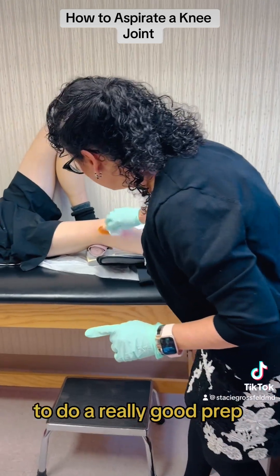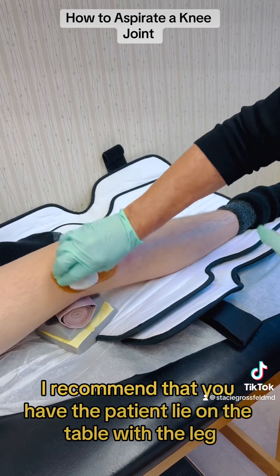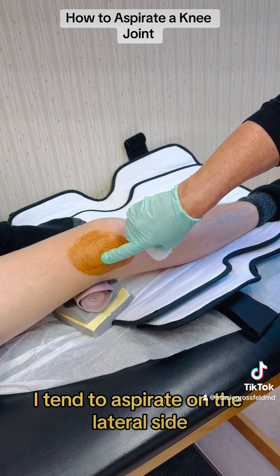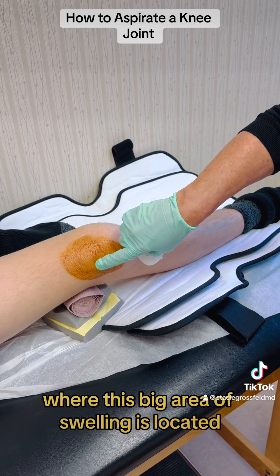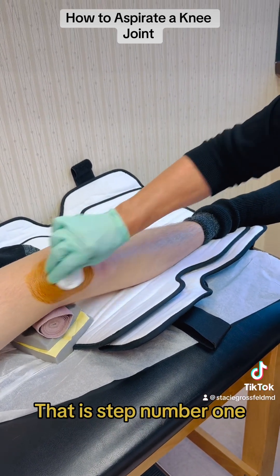Step number one: you want to do a really good prep. I recommend having the patient lie on the table with the leg in full extension. Usually the lateral side of the knee is really swollen, so I tend to aspirate on the lateral side where the big area of swelling is located. I'll do a betadine prep in this area.